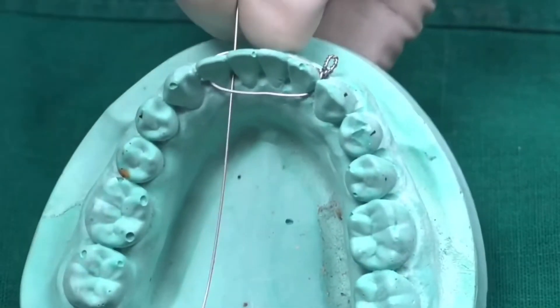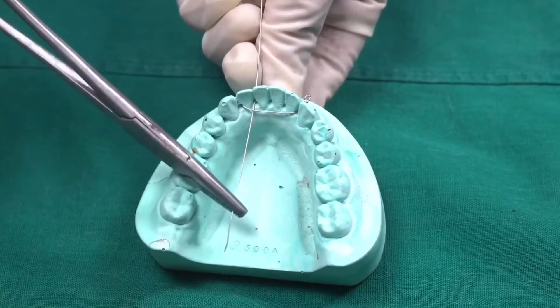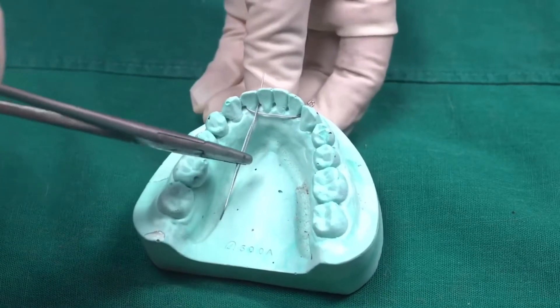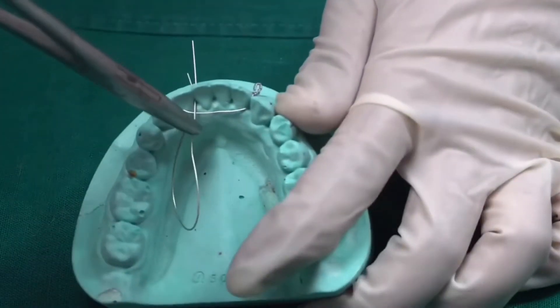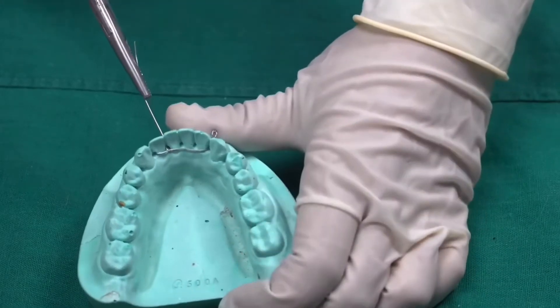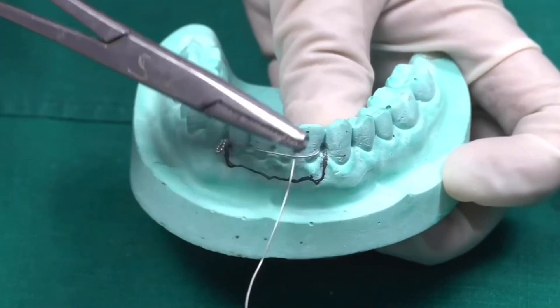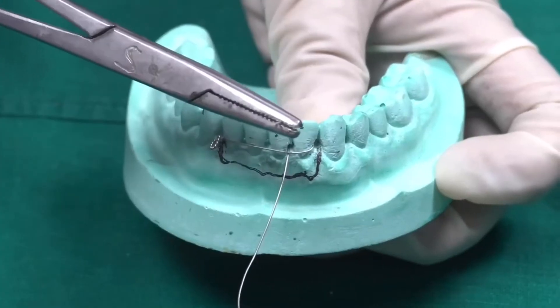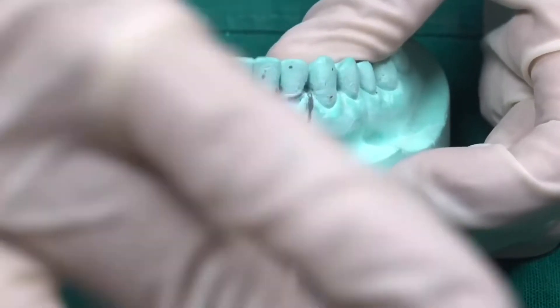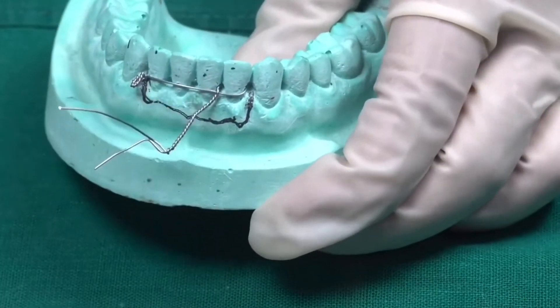Pass it below the lingual wire, then pull the same wire and pass it above the lingual wire through the interdental region towards the buccal side. The wire that has come back is above the buccal wire and the other one is below the buccal wire. Twist both of these wires together with a needle holder in a clockwise direction, then cut the wire short.